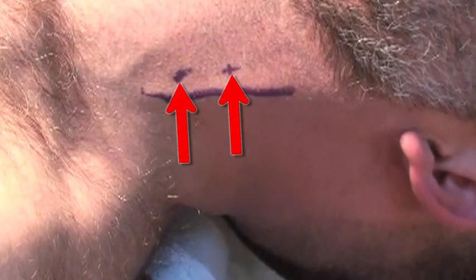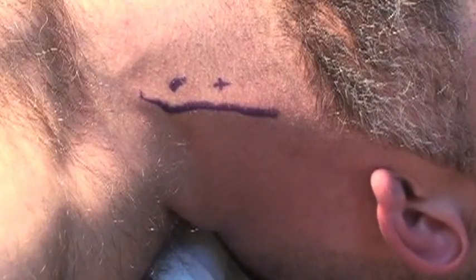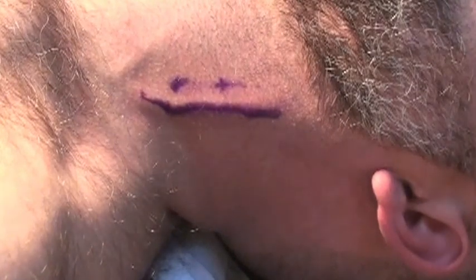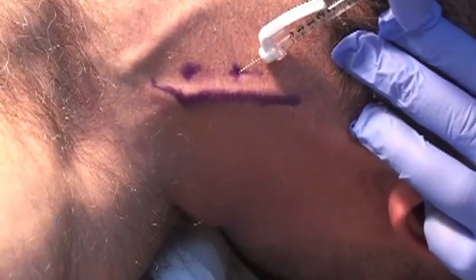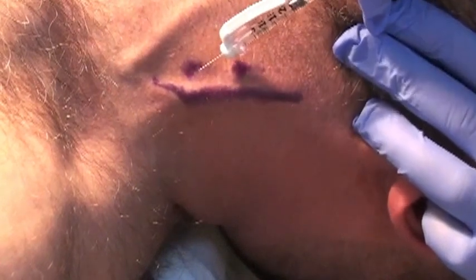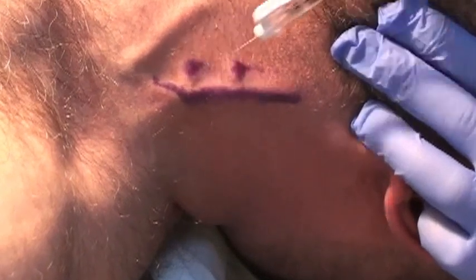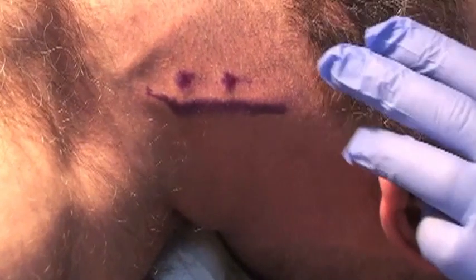The two little dots I put on there are for where I inject a tiny amount of lidocaine. Why do I do this? The patients are often extremely anxious, and putting an EJ in sometimes takes more than one try. If you stab your patient in the neck with a large metal spike over and over and it hurts every time, they are not going to cooperate with you. The con of putting in lidocaine is that it can obscure the landmarks a little bit — that's why I drew the line with a tissue marking pen.